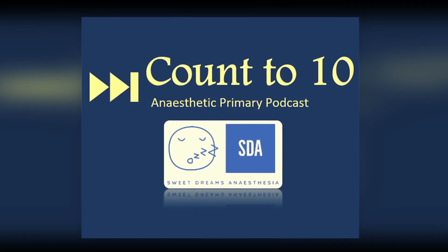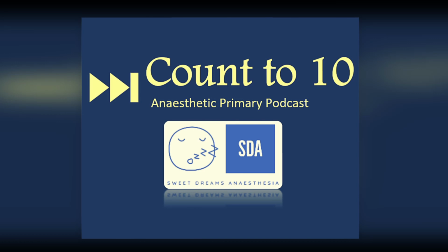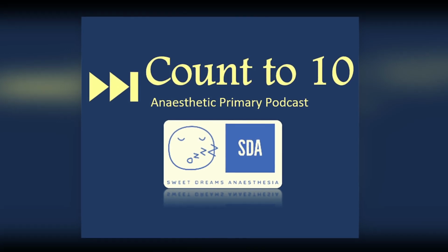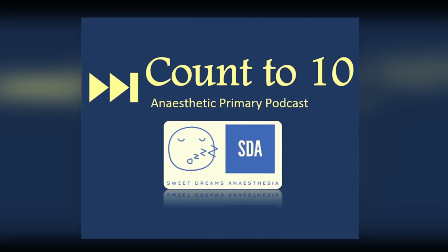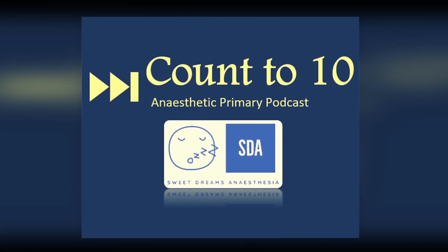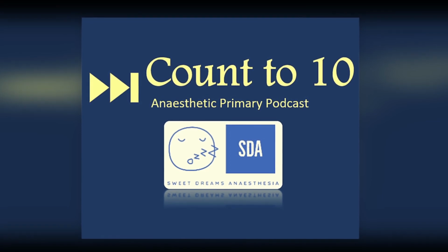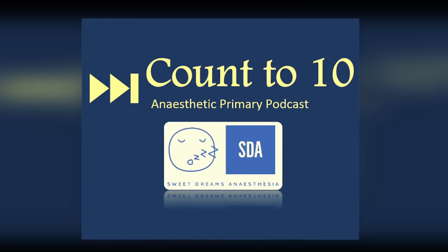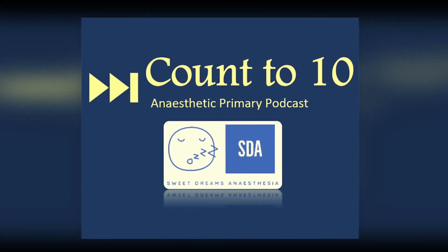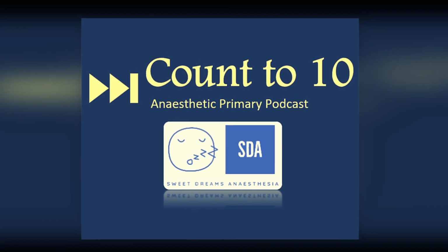Other patient errors can be due to disease states such as severe tricuspid regurg increasing venous pulsations, and now there's confusion created between which is the AC part of our equation and the DC part of our equation. The high venous pulsations can also be created by high IPPV and high peak airway pressures, and less commonly the errors can be created by devices such as an intra-aortic balloon pump, which then confuses the signal again.